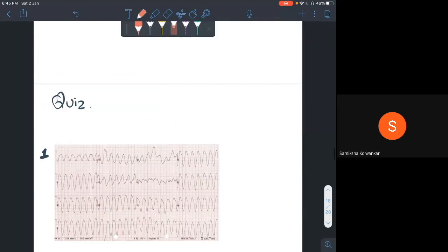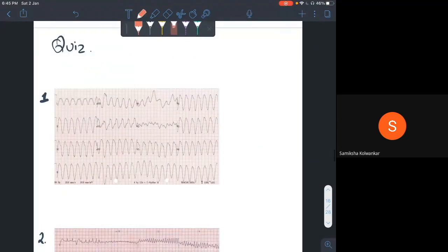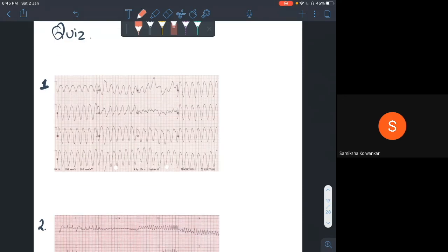It is pretty much like they show it in the movies. The patient does jerk. You do need to look at the ECG every time you give the shock. You do need to hope to God that the ECG goes back to normal. And the failure rate is quite high because once the heart has entered into a VTAC sort of situation, it's difficult to get out.